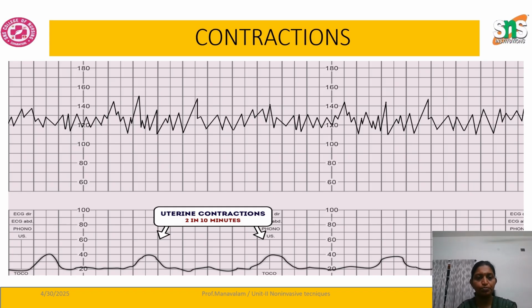Between these two vertical lines, there are 10 boxes. Each individual box is equal to 1 minute, so totally 10 boxes, and in conclusion this is considered a 10 minute window period.